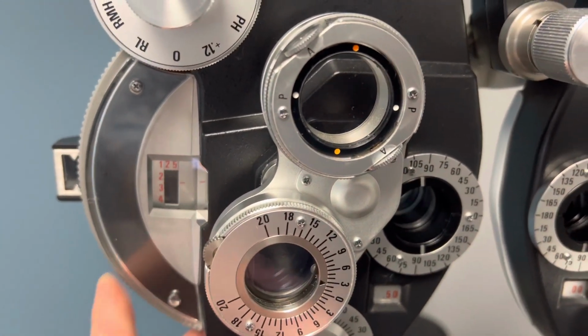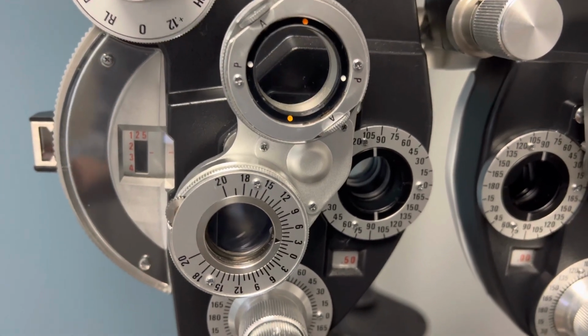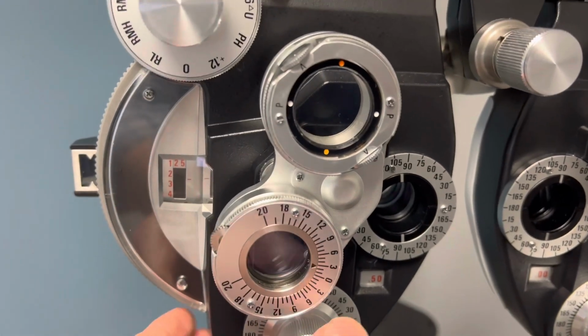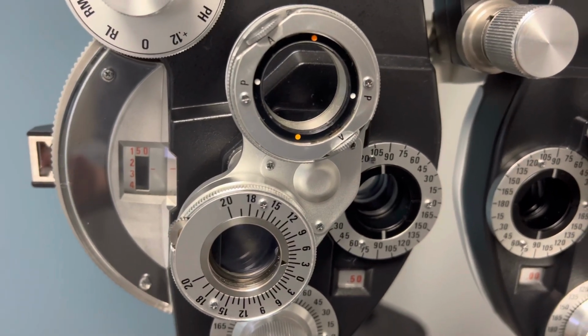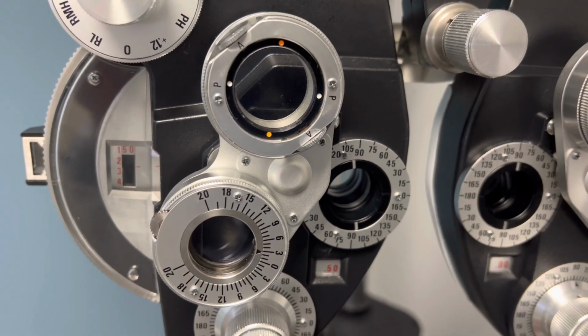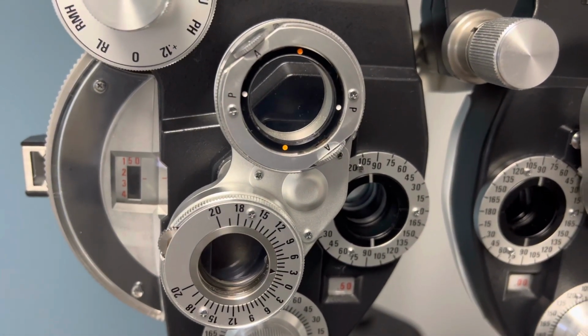So I will put the 20/20 line on the chart and then I will click in an extra click of minus here, and I'll say, does that line look a little bit clearer? And you'll say, yes, it actually does look clearer. I still can't quite see it yet though. So let me give you another click here. So we'll give you another click, and then you can read all the letters. So my goal is for you to be able to read all of the letters with the least amount of prescription that it takes to get you to see those letters.